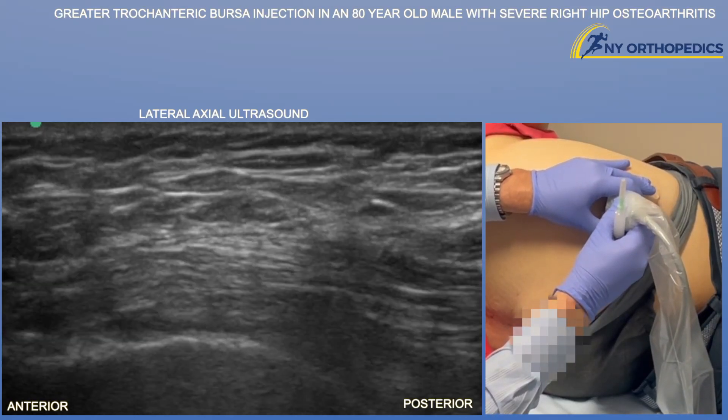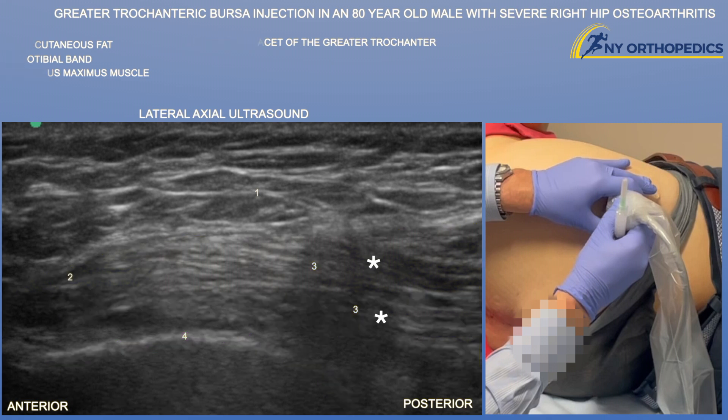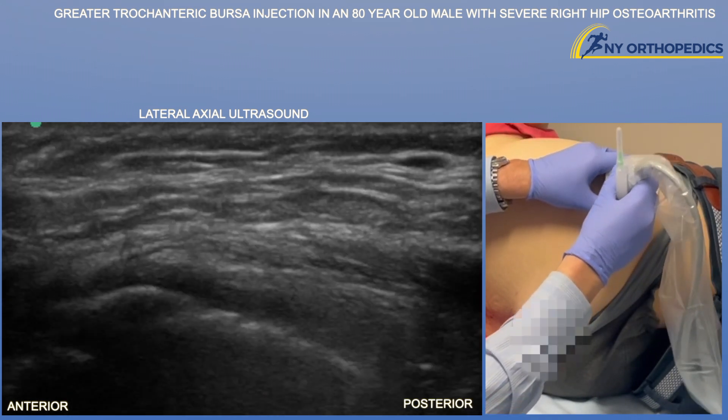Going posteriorly, we can start seeing that rounded posterior facet of the greater trochanter. Nothing attaches to that facet. However, the gluteus maximus muscle is essentially lying on top of it, which you can appreciate here.